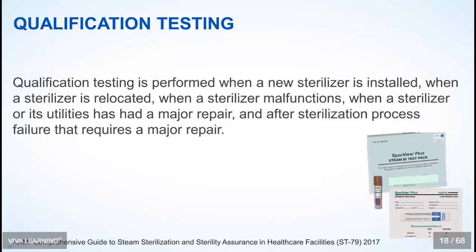I will also mention tonight that each of our mainstream sterilizer manufacturers includes qualification testing as a process in the IFUs for their units. So it may be something that you want to look into doing as best practice. Essentially, what you're doing is using a PCD, or process challenge device. It's going to be a box, just like the Bowie-Dick is in a box, and that box contains a stack of cardstock. The middle cardstock, instead of having a chemical indicator, may have a type 5 or an integrating indicator, or it may have a self-contained BI vial like you see in the picture.